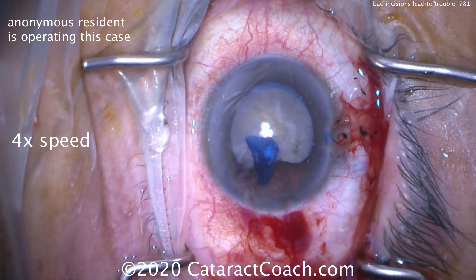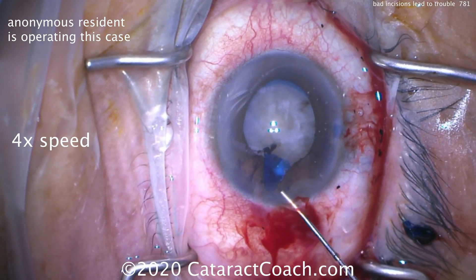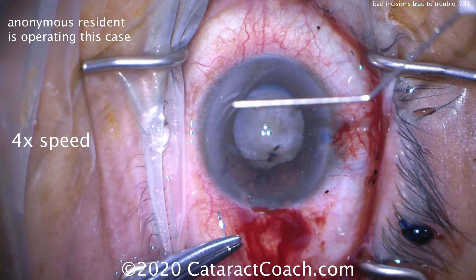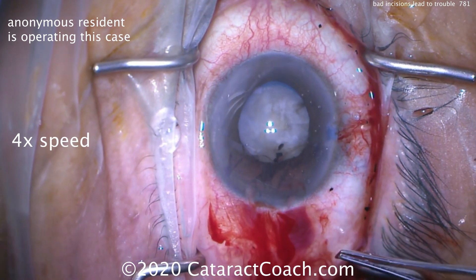So what's the best move here? We sped up the video because I want to show you that the best move here is not to continue through that incision. That incision needs to be closed, quite frankly.